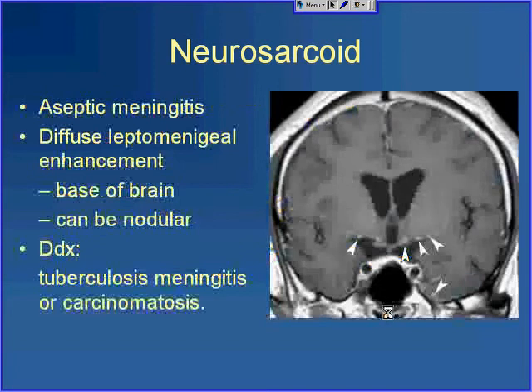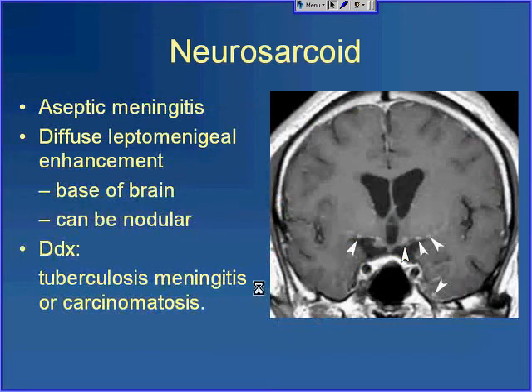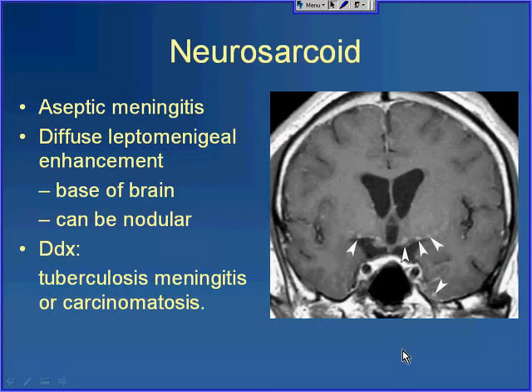One presentation of neurosarcoid is aseptic meningitis, with diffuse leptomeningeal enhancement tending to go to the base of the brain. This can be quite nodular — as in this example, where you can see nodular enhancement of the leptomeninges on T1 post-contrast imaging. If you have this presentation, you'd include sarcoid in your differential, but leptomeningeal carcinomatosis, tuberculosis, or other infectious meningitis would probably come first.